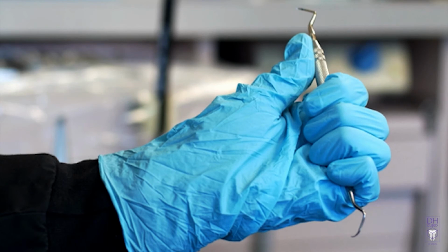Using the 110 sharpening device, we recommend holding the instrument in your non-dominant hand with the tip of the instrument facing towards your body. You need to be able to see the face of the instrument clearly in order to keep it parallel to the floor. Look at how the hygienist is holding the instrument and where each finger is placed for a solid grasp and a neutral wrist. The thumb is placed firmly against the handle in order to stabilize any possible movement during the sharpening process. You want to be sure the instrument doesn't wobble or shift while applying pressure during sharpening.